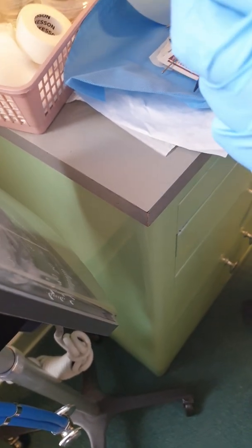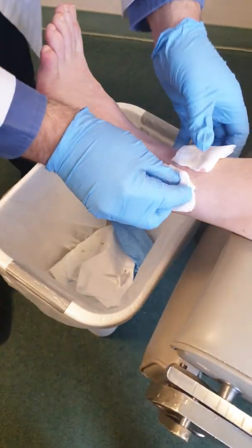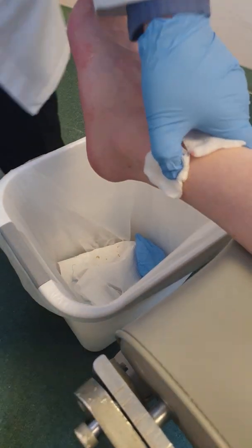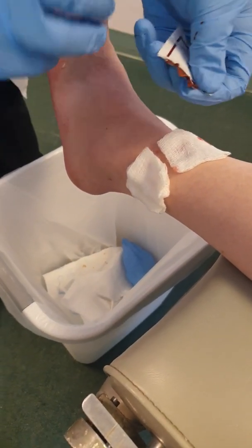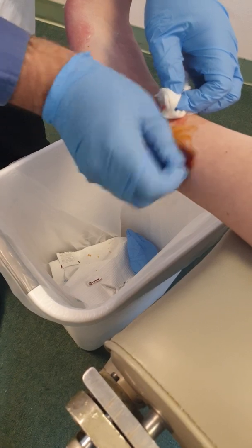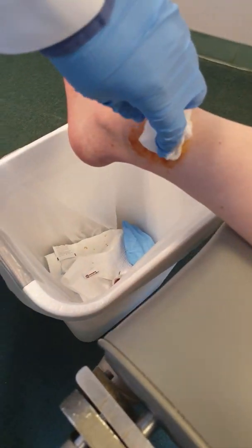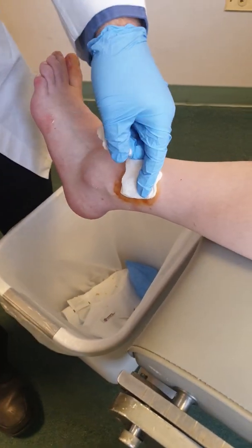That's the first one done. We put one Neosporin and a band-aid, and that's all we do. I usually try to sterilize it a little bit, and once I sterilize it again, I put a band-aid on there.